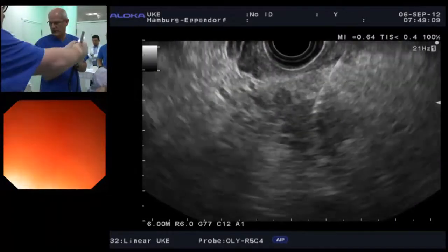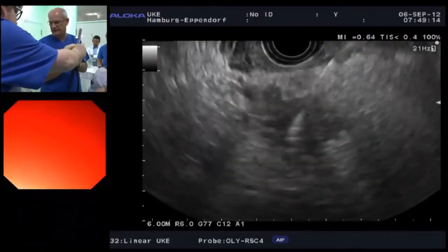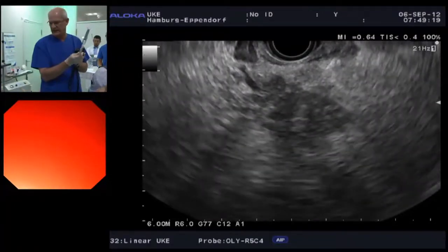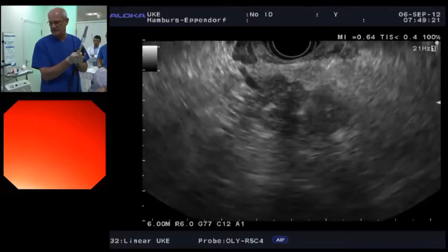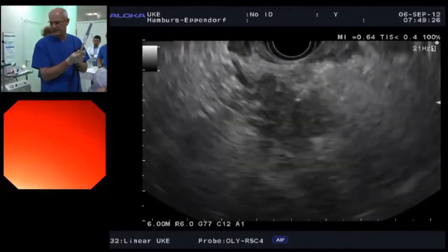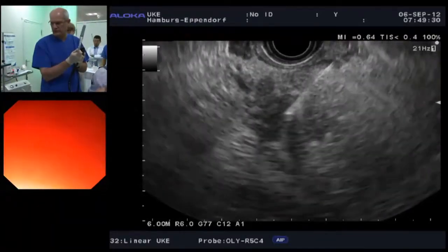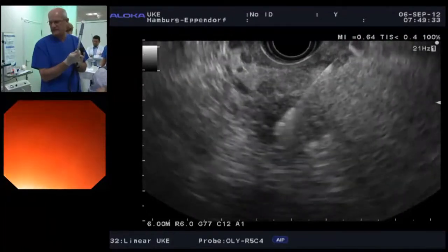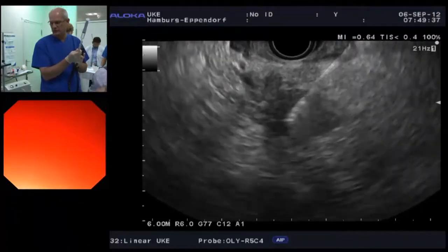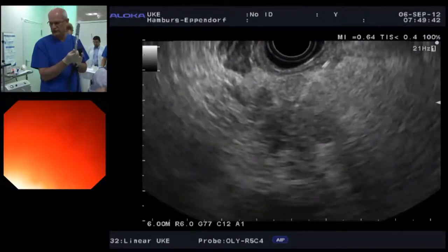I think that what I do is I go a lot by feel now, Mike. If an area of a tumor is soft, I tend to avoid that area. And if it's firm, I tend to go to it and spend my time in that. But I think the point is well taken. I think the idea to take home is basically we need to be looking at the tumor, feeling the tumor, and trying to go to the areas that are likely going to yield tumor cells.